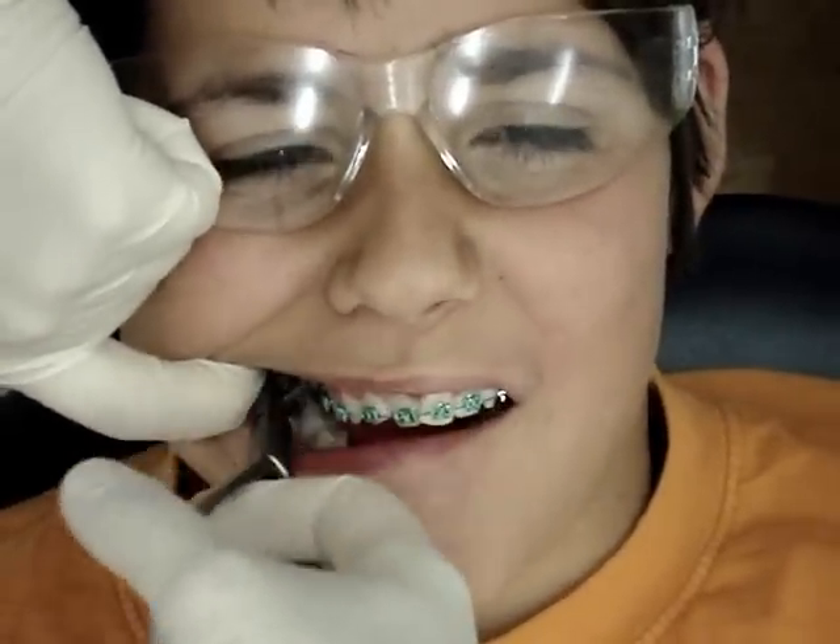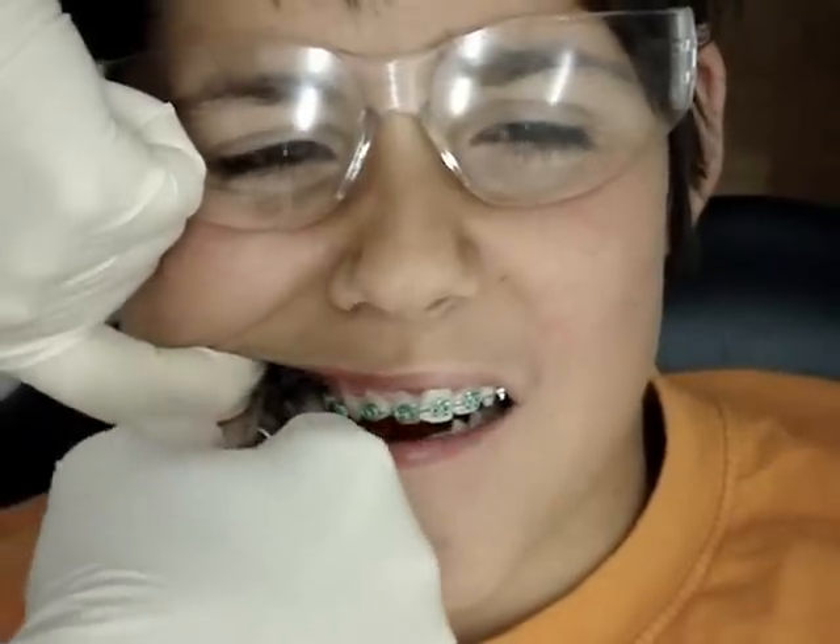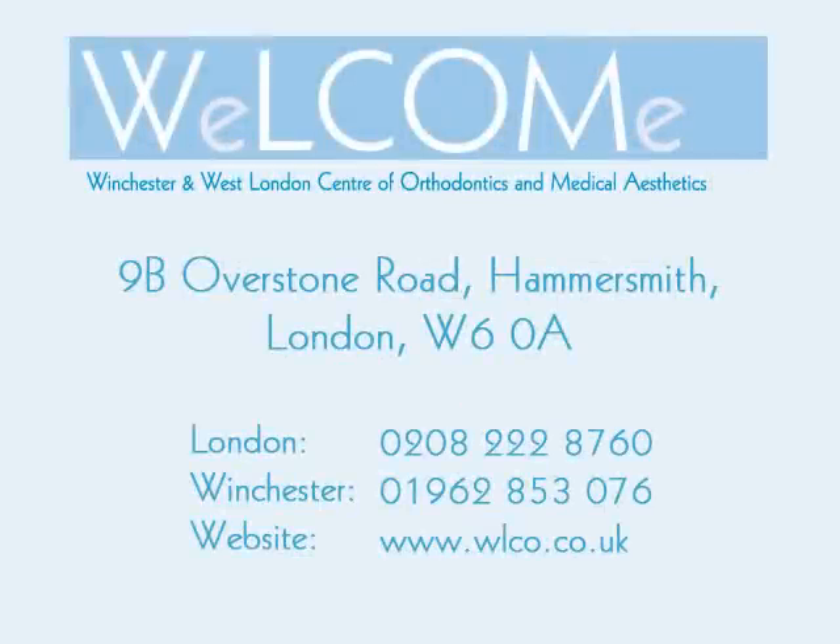Right now you are biting over the tooth. I'm going to place them in X's.